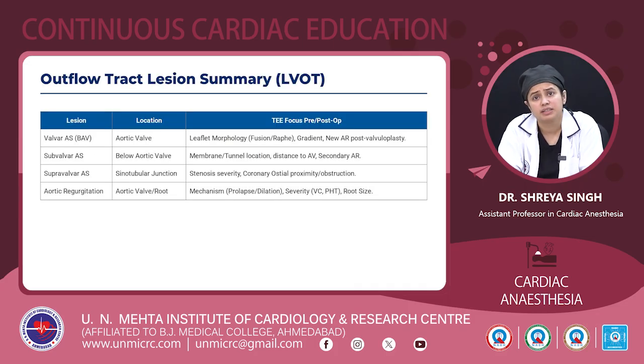So to summarize, the outflow tract lesions that TEE helps us with are valvular aortic stenosis, where we can look for leaflet morphology, gradient, and new AR post-valvuloplasty. In subvalvular AS, we can look for membrane or tunnel location, the distance to the aortic valve, and any secondary aortic regurgitation. In supravalvular AS, we can look for stenosis severity and coronary ostial proximity or obstruction. For aortic regurgitation, we determine the mechanism, the severity, and the root size of the aortic valve.